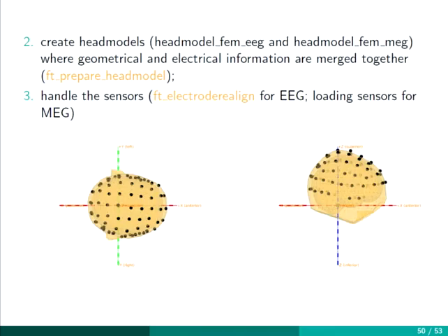Yeah, I think basically you go for the template approach. You just take a template. Yeah, it's of course feasible. Of course, then you have problems with variation. A template is just a template for one subject. Imagine my head and Carla's head, of course, the template doesn't apply. So then you of course are prone to errors already. So it's always better to record electrodes, but if you can't, there might be good reasons for that. But then you can still use templates for that.